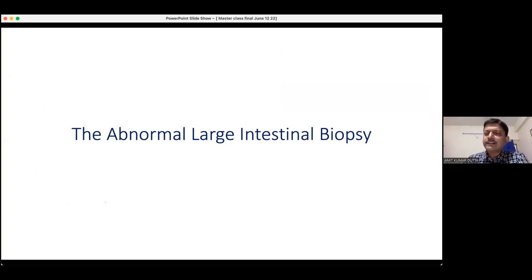So ma'am, when we send biopsies, you may sometimes say it's a superficial biopsy, not adequate. What does a superficial biopsy mean, and when is a biopsy depth adequate for a pathology description? Yeah, the depth of the biopsy is particularly important if you're evaluating for IBD, because inflammatory changes in IBD classically happen in the deep part of the mucosa. If you see inflammation in the superficial part of the mucosa, you don't diagnose IBD. So unless you have the deep part of the mucosa in the biopsy, it's not very useful.